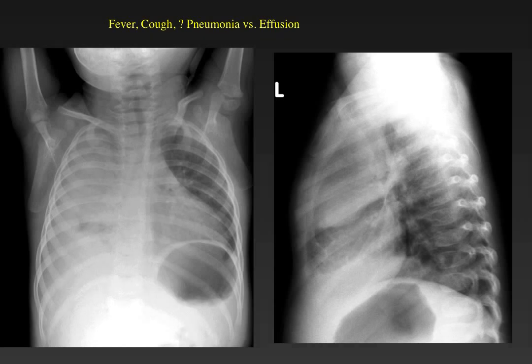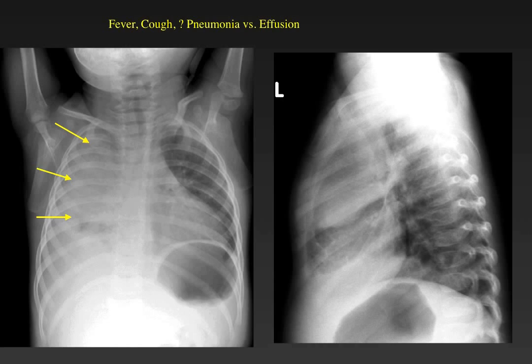Here is another child where the entire right lung is much denser than the left lung. We can see that the trachea is displaced away from the dense lung, and that the lung on the right side only occupies the medial half of the right hemithorax because the lateral aspect of that hemithorax is occupied by a pleural effusion. On the lateral view, this confirms both parenchymal density and fluid.